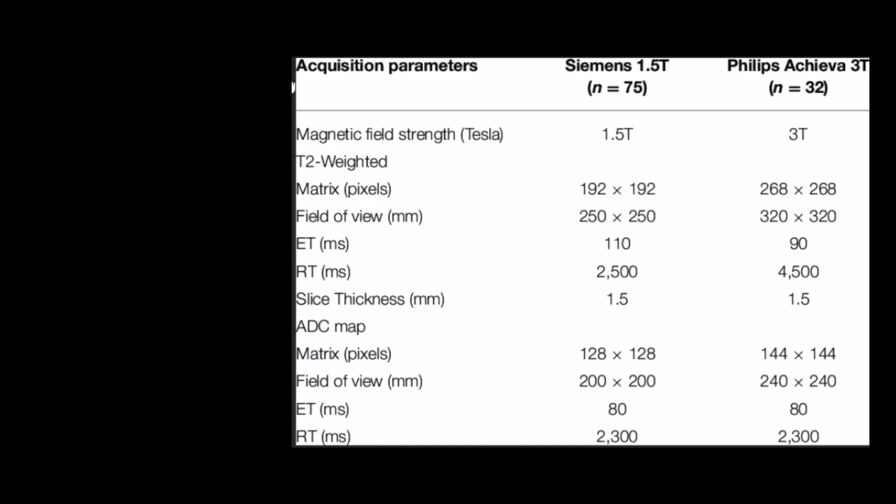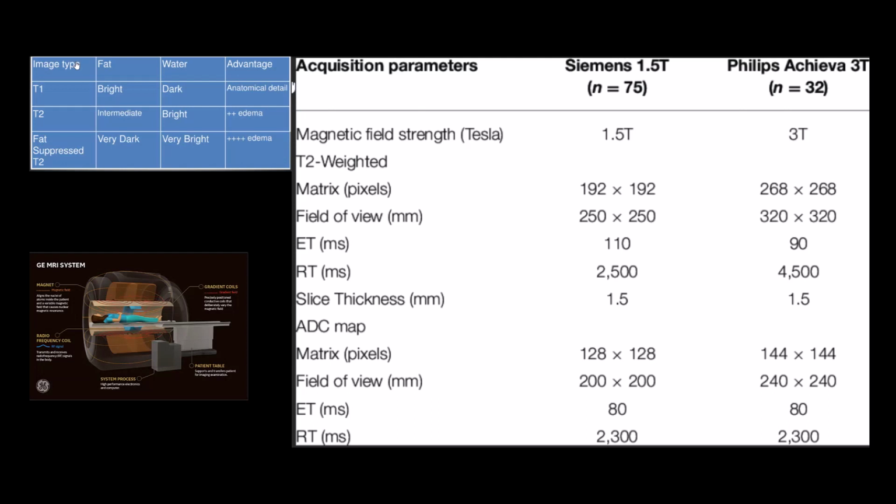We've looked at the acquisition using gradient and spin echo, but what are the acquisition parameters that are set by the person creating the images? What are the acquisition parameters? Just as techniques are set for ionizing radiation imaging, we also have parameters that need to be set for techniques in magnetic resonance imaging, and these vary dependent upon the facility, the strength of the magnet you have, and the type of images you need to collect.